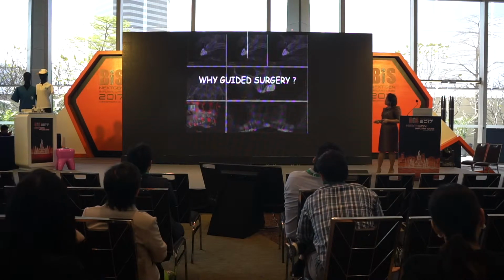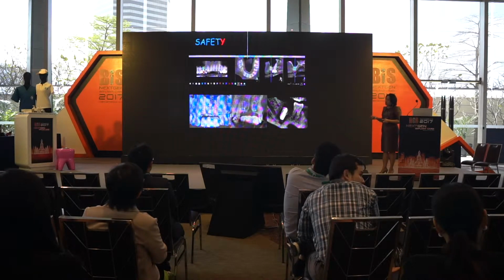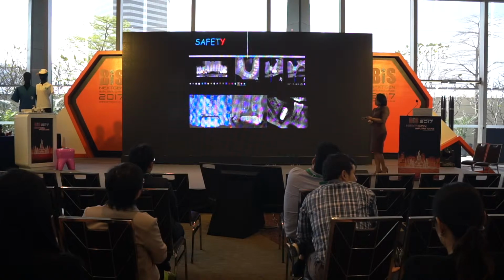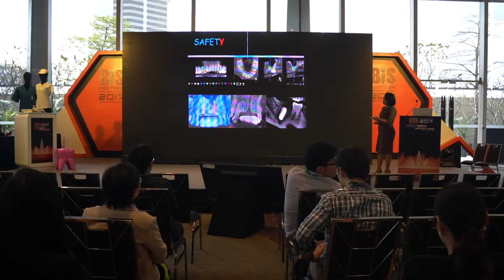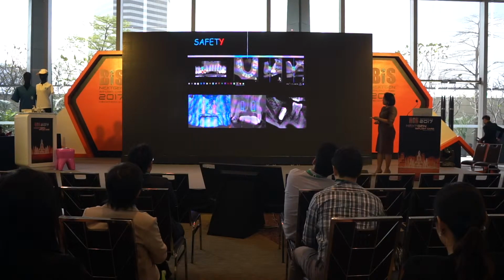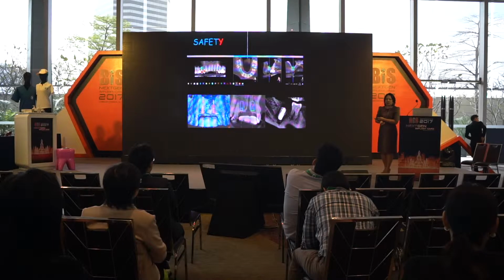Why guided surgery? There are many reasons why we use guided surgery. First of all is patient safety. With the CBCT, you can see where the nerve is, where the sinus is, and where the bone volume is that is available enough to place the implant diameter that you want.